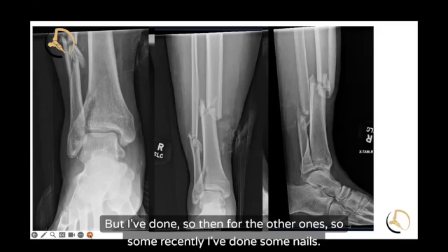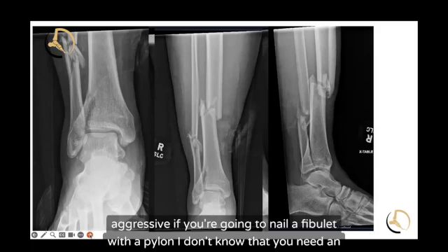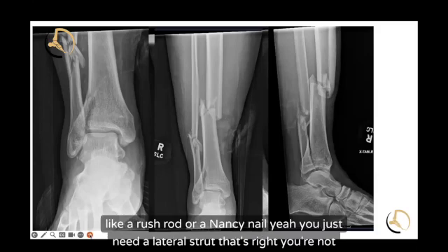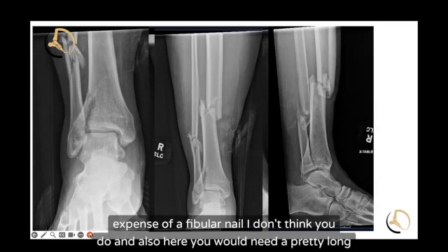For cases where I've done nails recently, I don't think you need aggressive fixation like a fibular nail when you're nailing a pilon. I think if I'm going to nail it, it's probably like a Rush rod or a Nancy nail. You just need a lateral strut — you're not really getting rotational control. So do you need the expense of a fibular nail? I don't think you do.